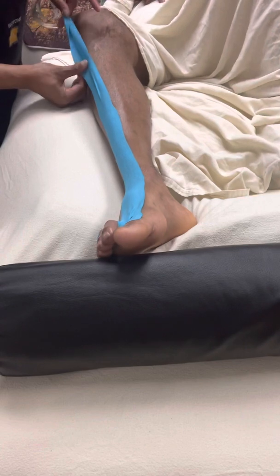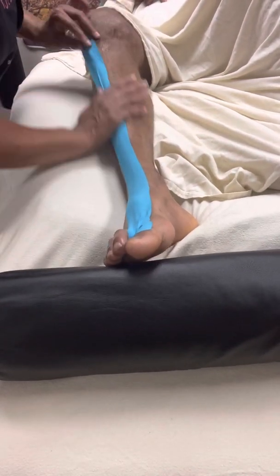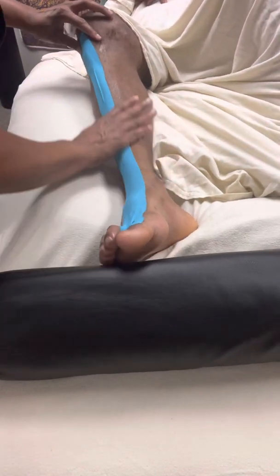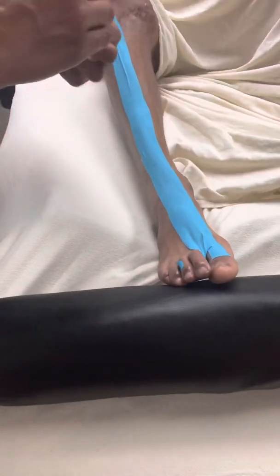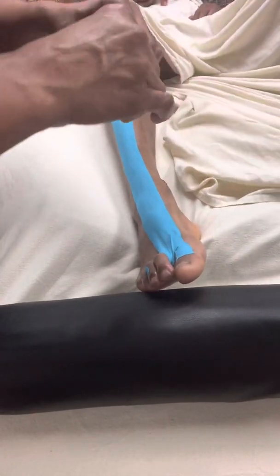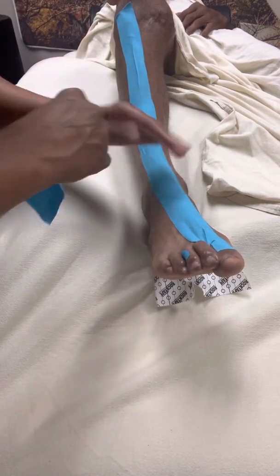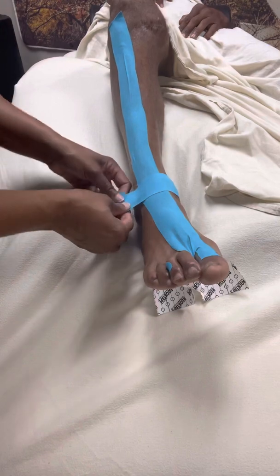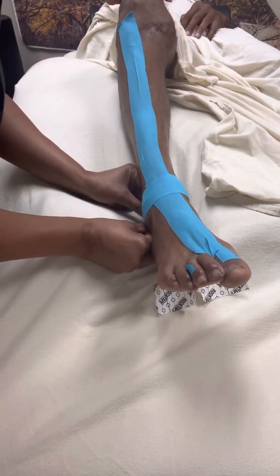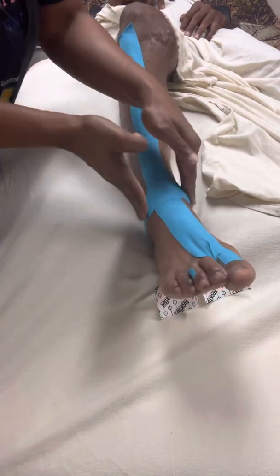I'm going to max out my stretch of the tape, bring it here. I'm just warming the tape up so it adheres to the skin on his leg. Then I'm going to take my second piece of tape, tear it in the middle, and then place it across his ankle here, doing a 100% stretch and moving it around the ankle. I'm just taking my fingers and warming the glue on the tape up so it's going to adhere to his skin.